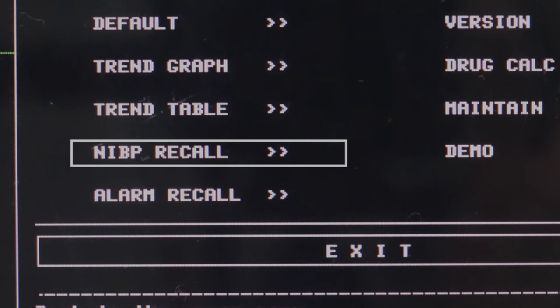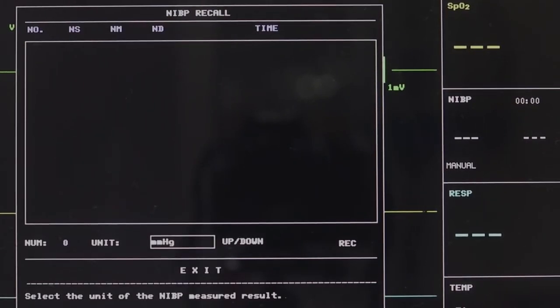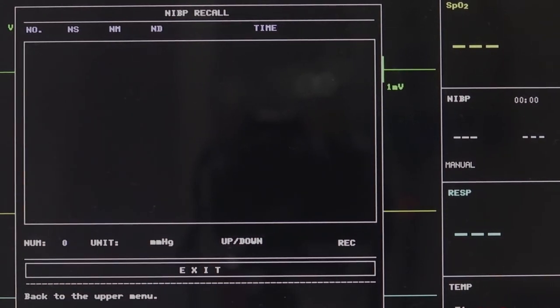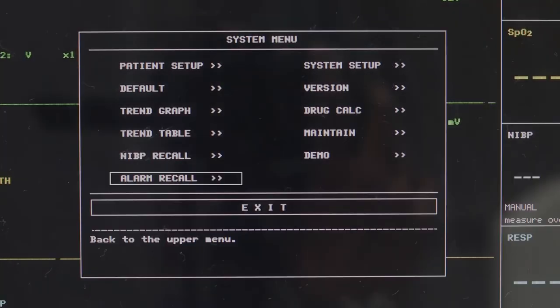NIBP Recall: This invokes the result and time of the latest 9 NIBP measurements. Data is listed chronologically from the latest to the earliest. Click on the exit to return to the system menu dialog box.